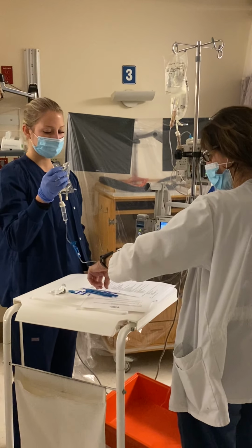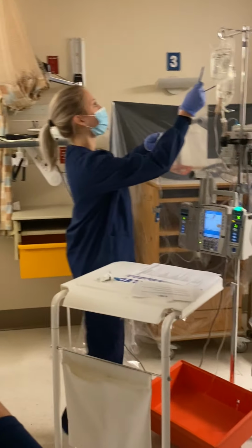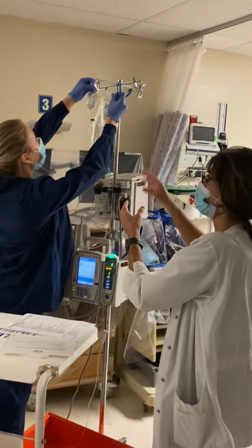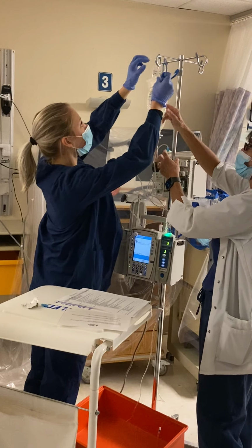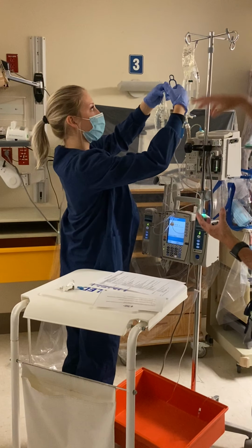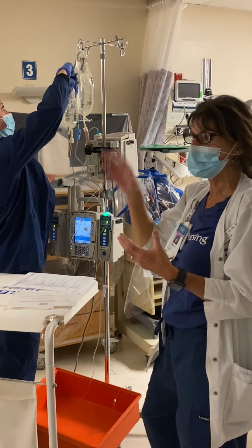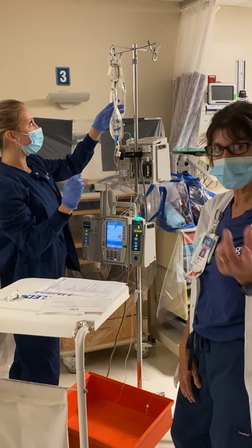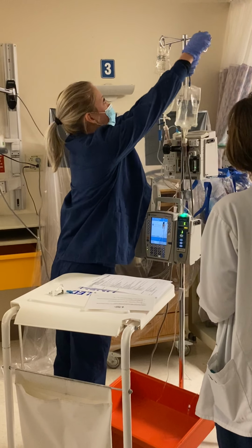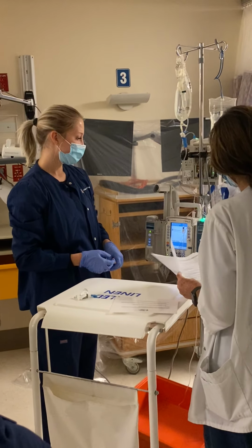Now that you've back primed, you can hang that up, and then you can lower your primary bag. And really there's no order. If you wanted to hang that first, and make this lower before you back primed, I wouldn't have counted off for that. But it just seems easier to back prime when that one's higher. You'll see everybody do it differently. As long as you put the blue hook in before you start your pump, you're fine. Okay, perfect. So now you're ready to program your pump.